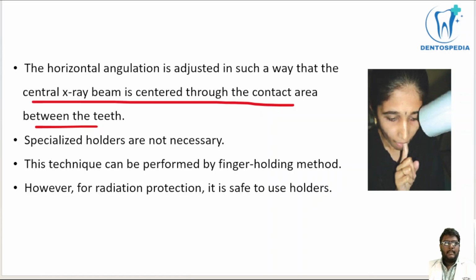Coming to this technique, there are no special holders. So here you might have seen, right, the patient is holding the film inside the oral cavity with a finger. If needed we can go for specialized holders, but they are not regularly used. And sometimes this technique is not followed because we are unnecessarily exposing the patient's hands to X-rays. We have learned that X-rays are ionizing, right? So that's why in a few situations we don't use this kind of technique.